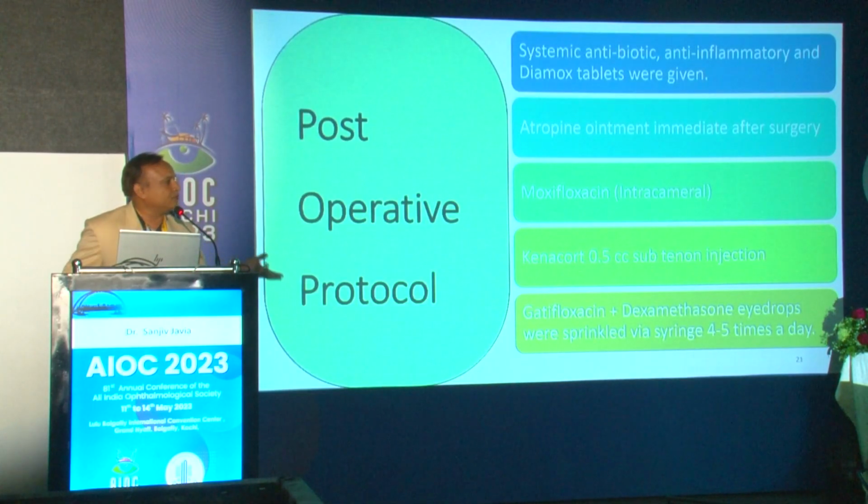I completed it. Now the IOL I put in the bag. The overall time was more than 1 hour, about 1:30. We planned bilateral at the same time, but it took 1.5 hours for the first eye. So we planned 10 days later, and we did the bilateral surgeries. Thank you.